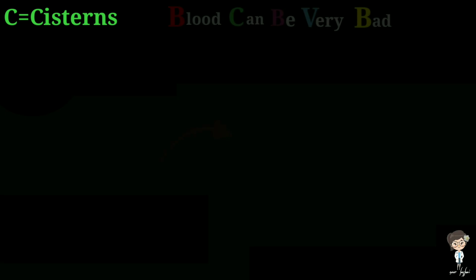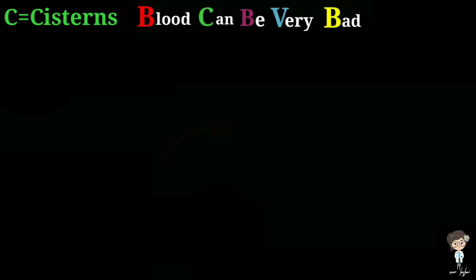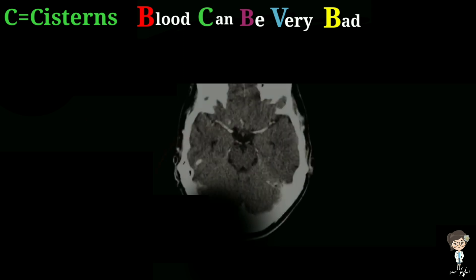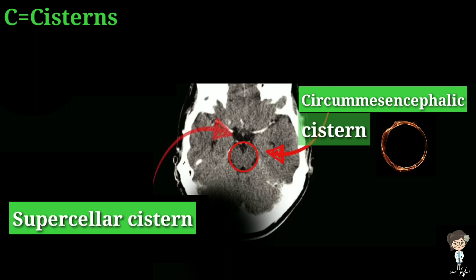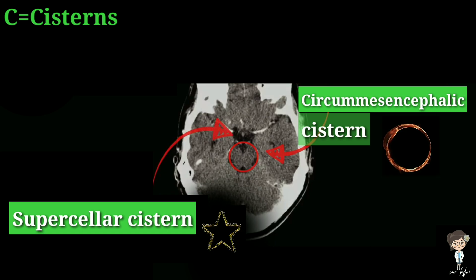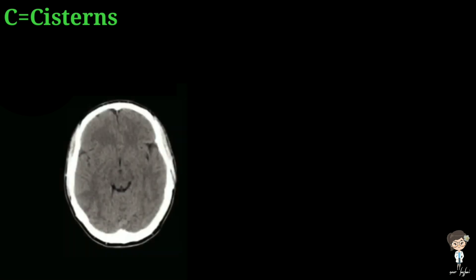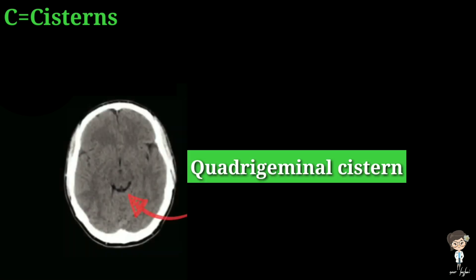The next part of the mnemonic is C, which stands for Cisterns. Cisterns which can be seen include the circummesencephalic cistern, which has a ring-shaped appearance around the midbrain, while the suprasellar cistern has a star-shaped appearance in the circle of Willis.